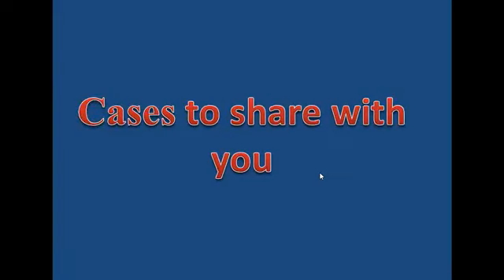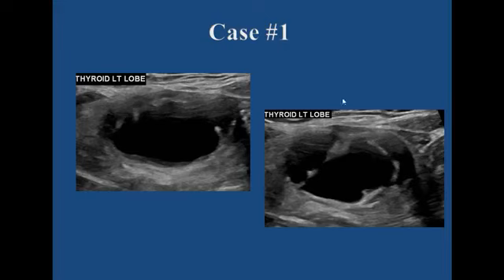So now I will go through some cases to discuss with you, and I do believe that TI-RADS is something practical. So if you don't use it, better to start using it, and if you use it, try to use it more. Just be familiar with the TI-RADS chart, put it in your room when you're scanning the patient, and start to apply it.